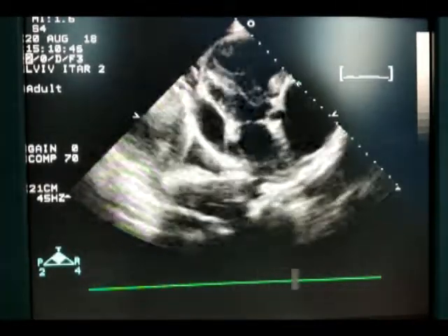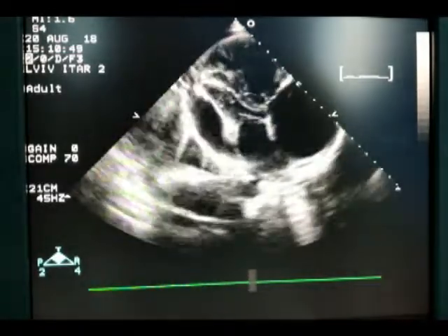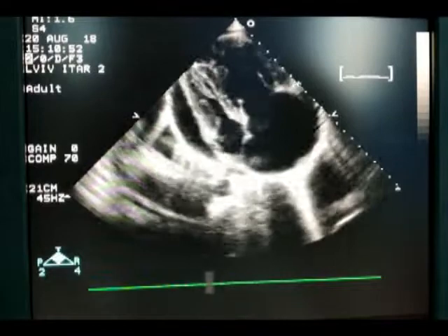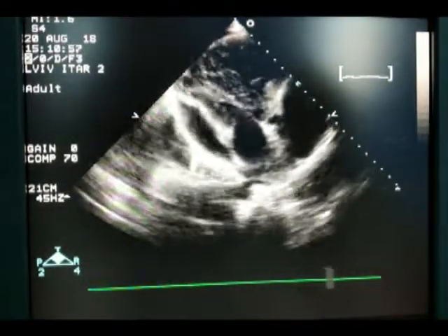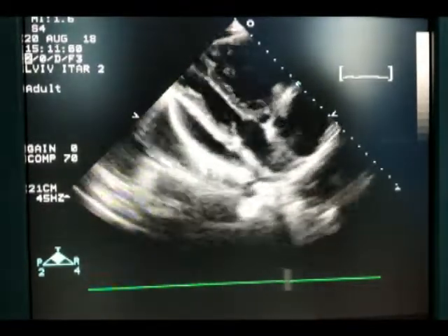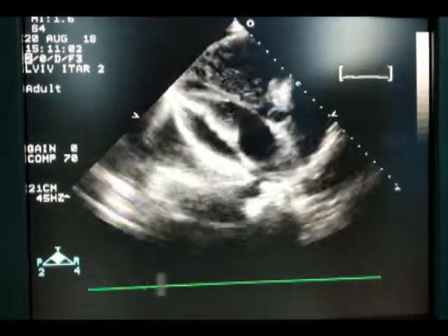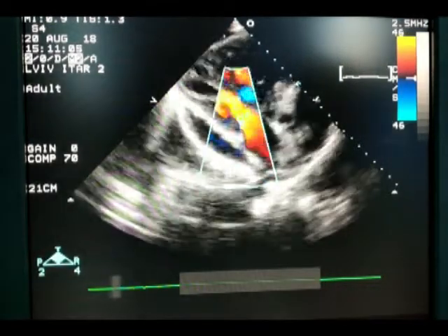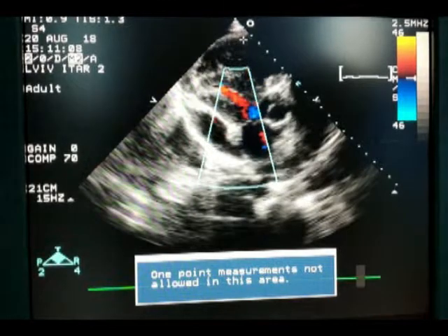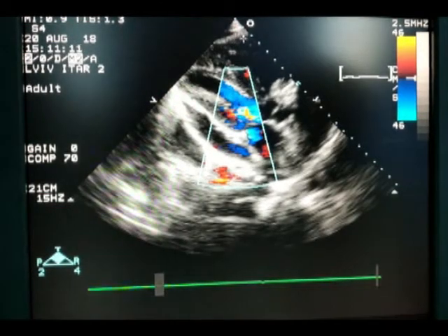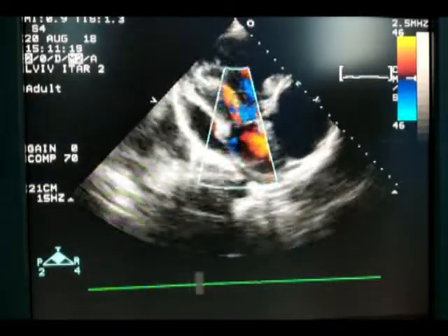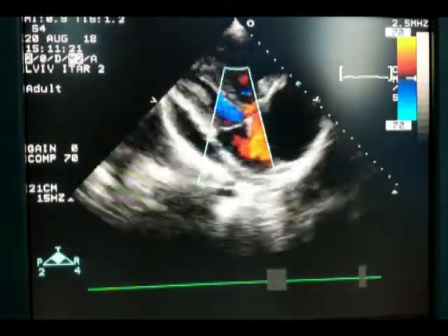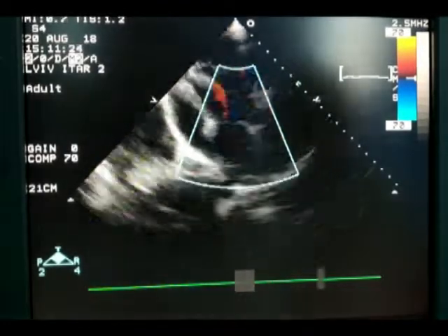After taking measurements we start to assess the mitral valve and aortic valve. Please pay attention to the color Doppler scale — it is not set correctly. Therefore, before we use color Doppler we must change the setting of the scale. Now the scale is set correctly. Now we enlarge the color box and assess the color flow across the mitral valve.